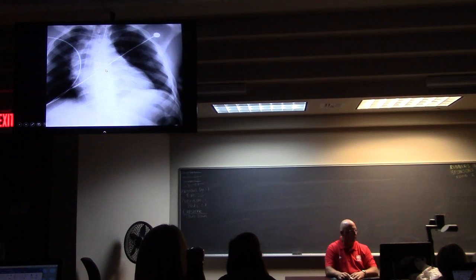All right. This is a trauma patient. Just to save time, I'll show. Notice that there's two ET tubes here. There's one in the esophagus, and there's one in the trachea. Intubated once by the paramedics and then once by the ER doc. I don't know who got it right. One of them got it wrong, one of them got it right. This is not one you'd want the attorney to find.